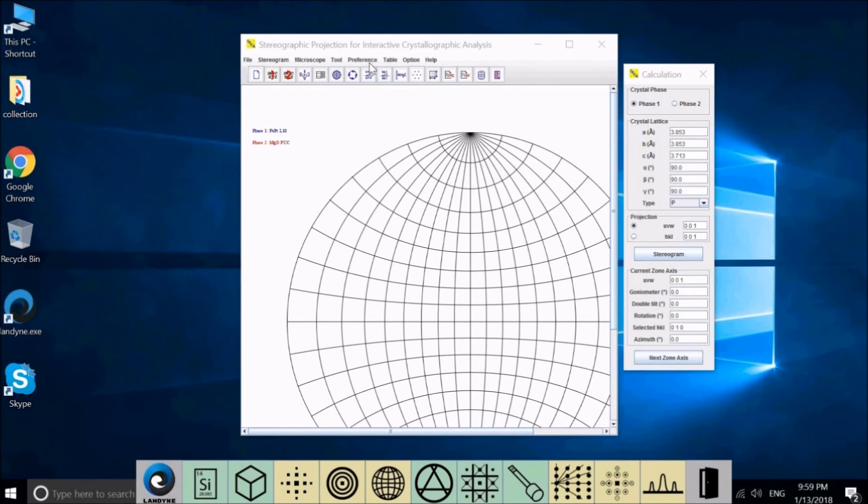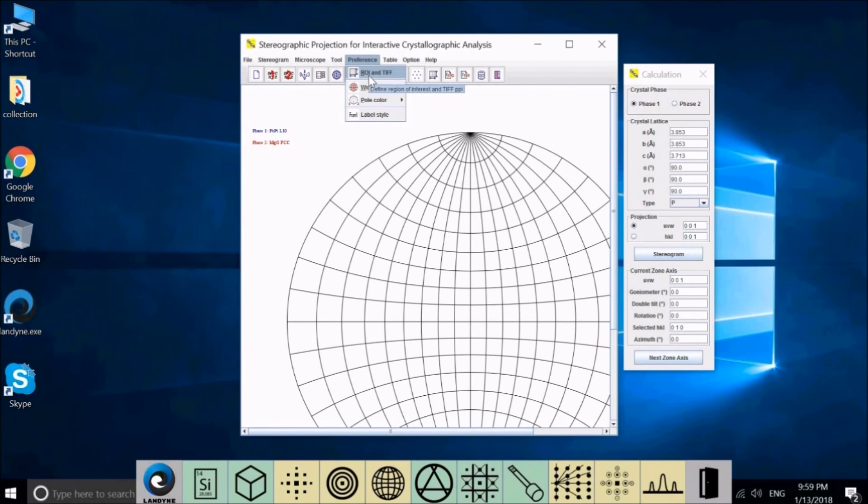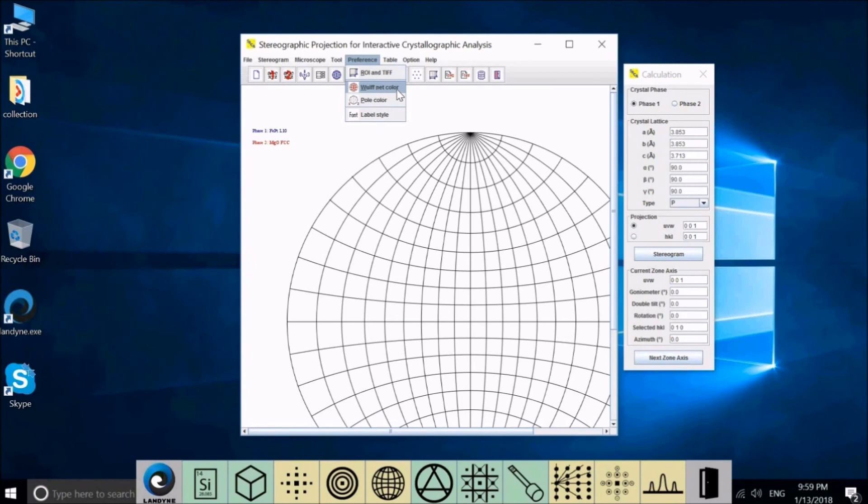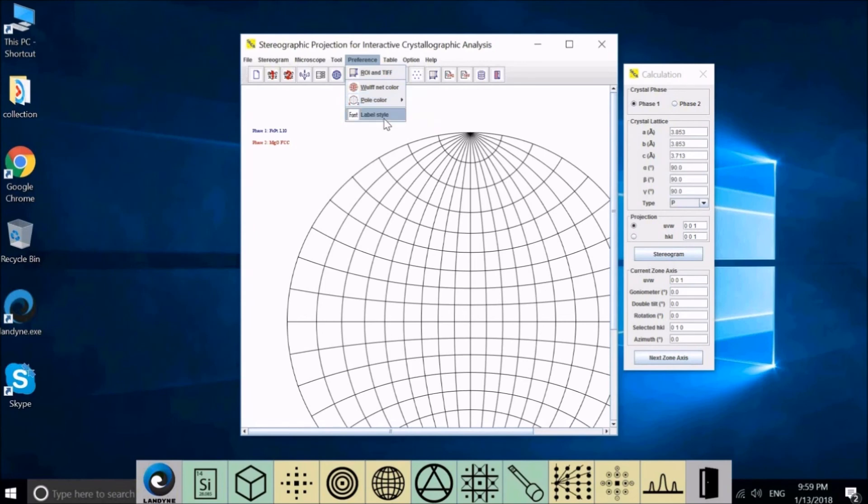In Preference, you have the choice of region of interest and set up the TIFF file resolution. You can choose the Wulff net color and the pole colors for phase one and phase two, and also you can set up the font for the labels for the poles.